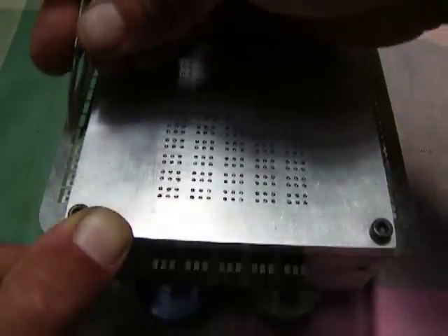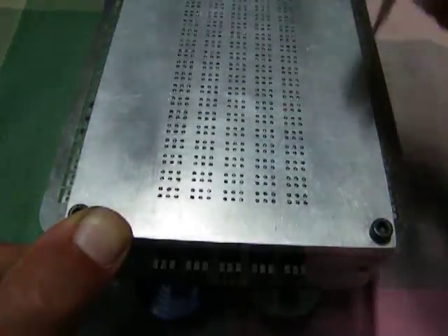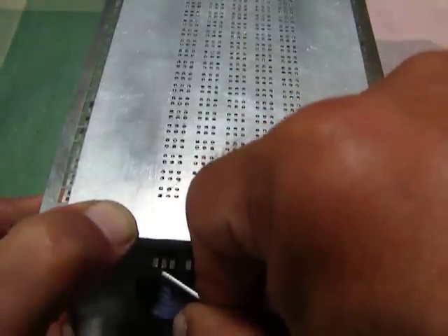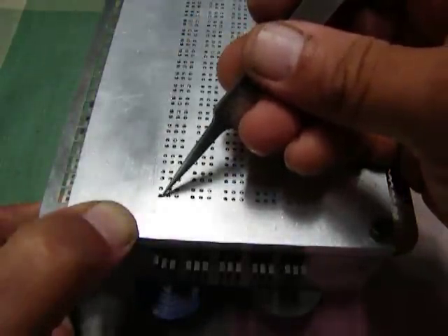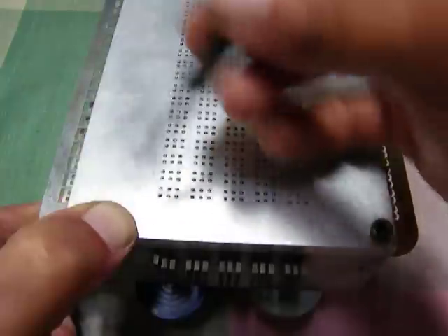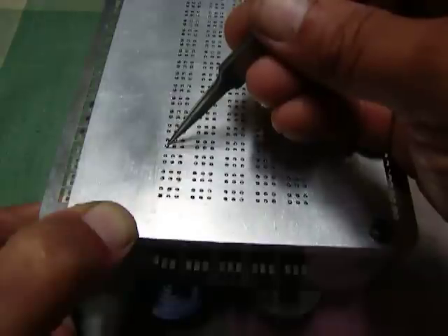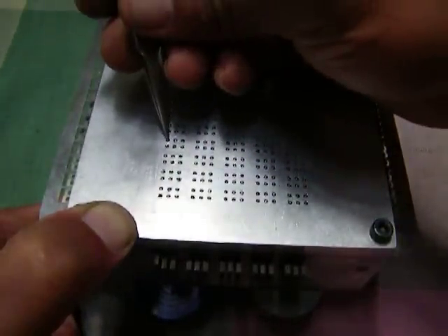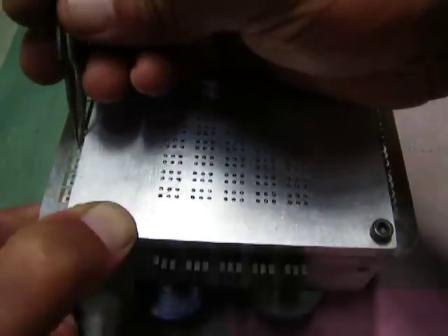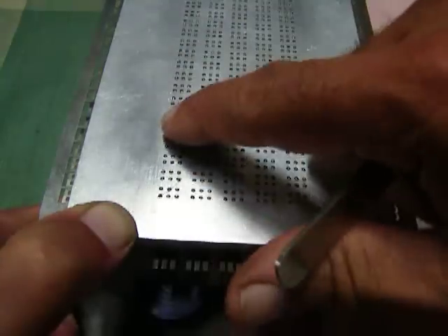Now suppose I want to set A in cell 4 over here. What I do is I enable cell 4, first column of cell 4. Let's just push it there a little bit, a millimeter there, and actuate row 1. Notice that since column 1 is latched, it retains its A position, and now only column 4A has come up. That's because column 4, the column as well as the row, are enabled. So I can latch column 4, pin A in that position, latch it shut. So even when I release the row actuator, it's there.